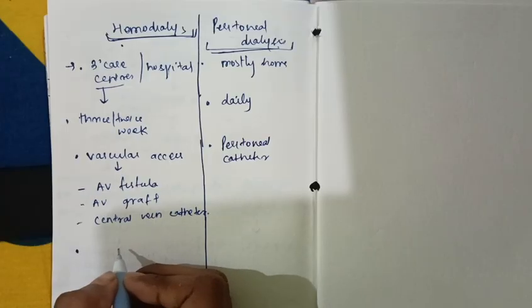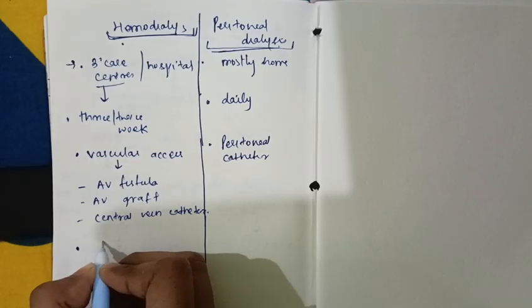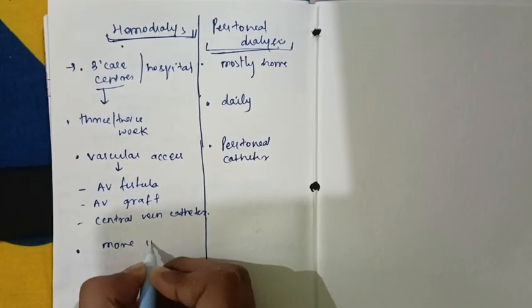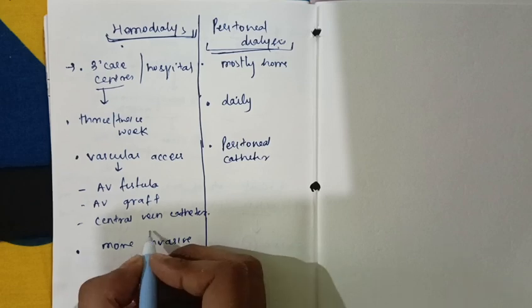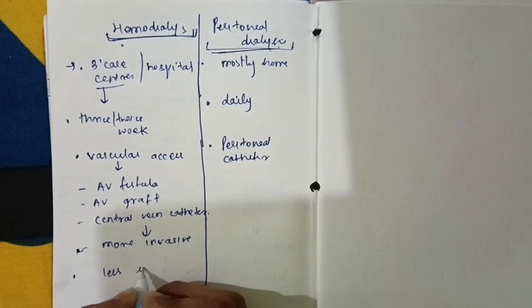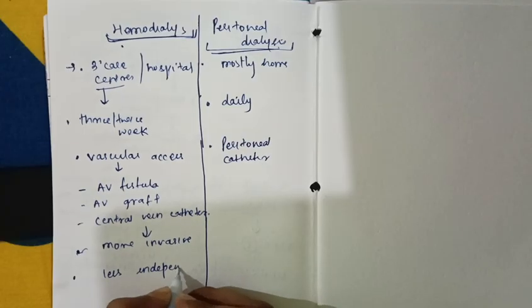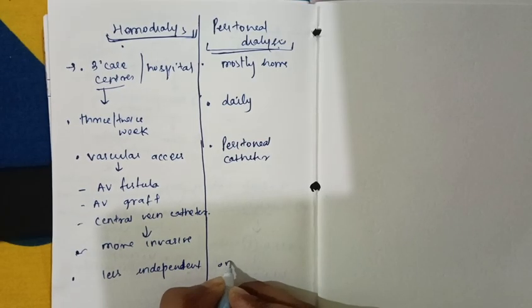Now the last one is invasiveness. Both of them are invasive, but hemodialysis is more invasive. And finally, peritoneal dialysis is more independent.